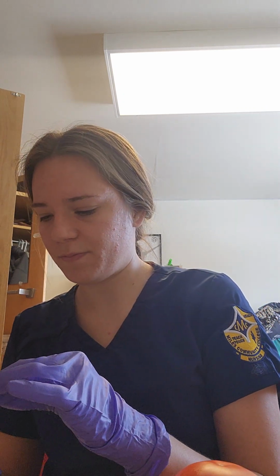So I'm going to get him prepped by cleansing the site. And since this is subcutaneous, I would give it in the abdomen. This time I will give it into the back of the arm because I did just give him his shot of insulin in the abdomen. So this is heparin, 5,000 units. And he is not an obese person again.